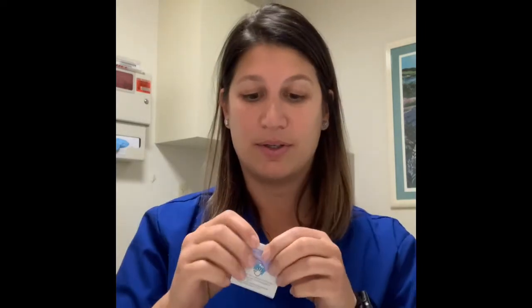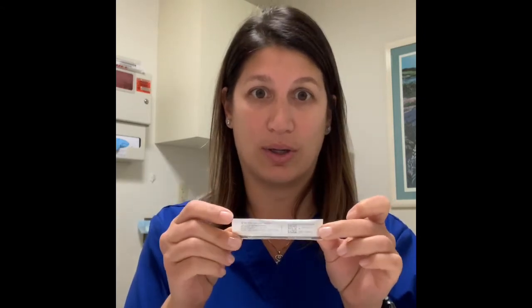Just like all other medications, you want to do this in a clean area with clean hands. When you go to use the vial for the first time, pop the top off with your alcohol wipes and wipe the top, then let it air dry. You should have a syringe with a needle already attached — the needle size should be an 18, 20, or 21 gauge. In addition to that syringe, you should also have separate 22 gauge needles that are one and a half inches long, which is correct for intramuscular injections. If you are on the thinner side, we will send smaller needles.